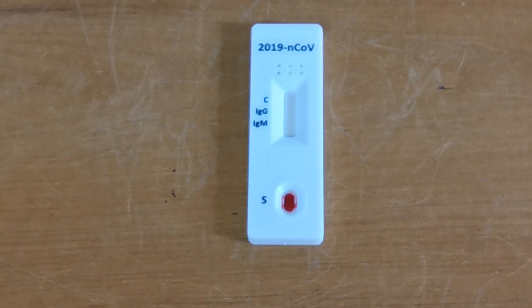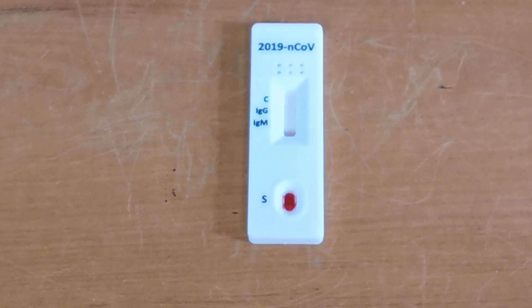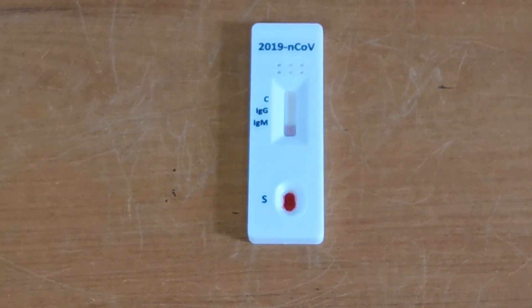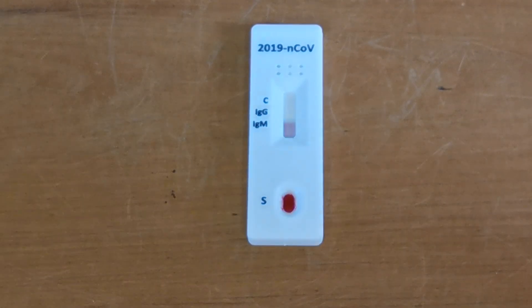Timer starts now for a 10-minute read time. You'll see the pink dye starting to come up through the results well here. We are going to pause this video now and show you the results at the 10-minute read time — welcome you back at that point showing the results of this 2019 nCoV rapid test.